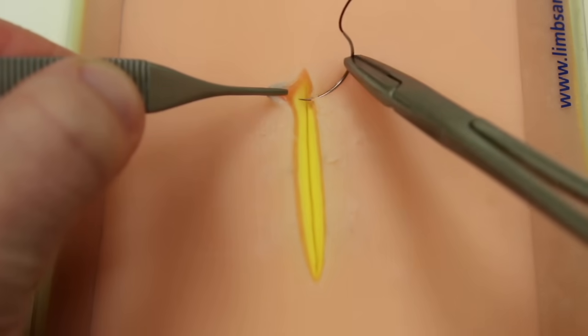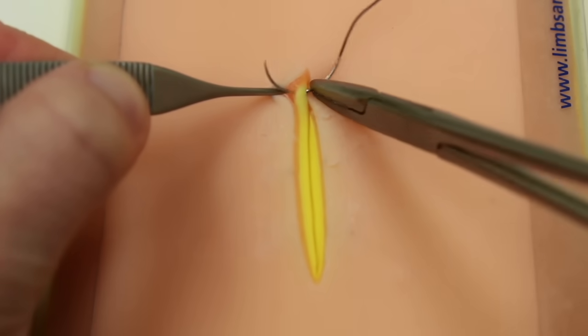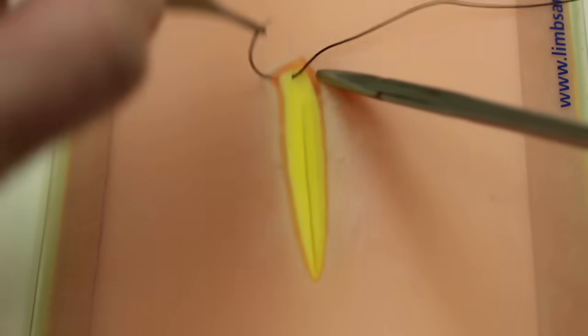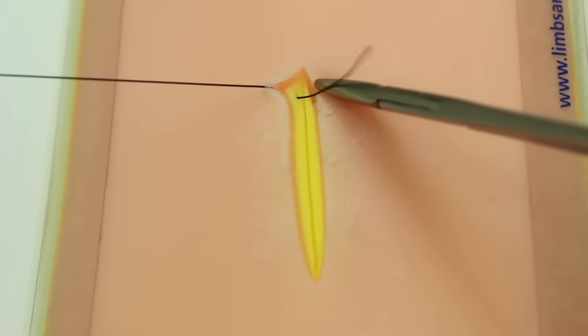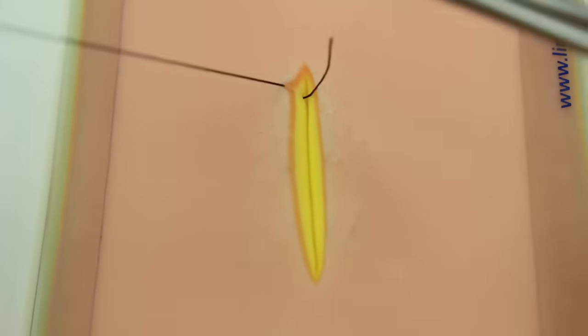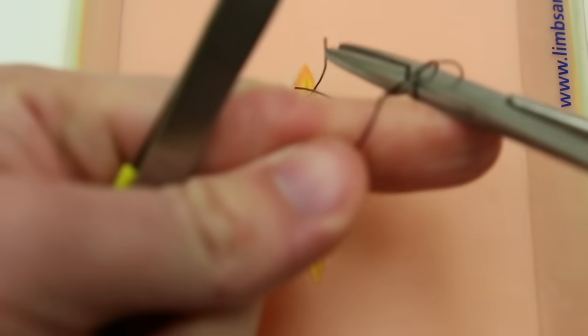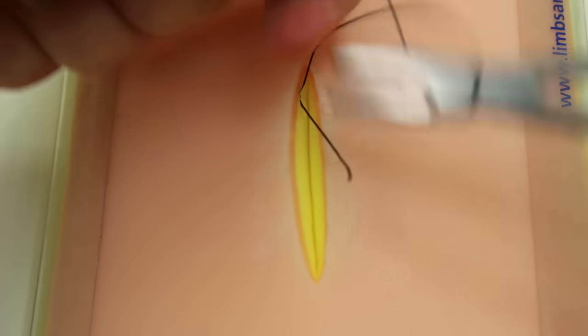Your first move is just to grab some of that dermis for an anchoring stitch. Just grab something deep up near the top of the incision and go ahead and tie that down.